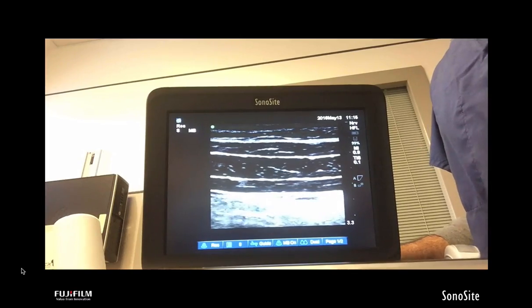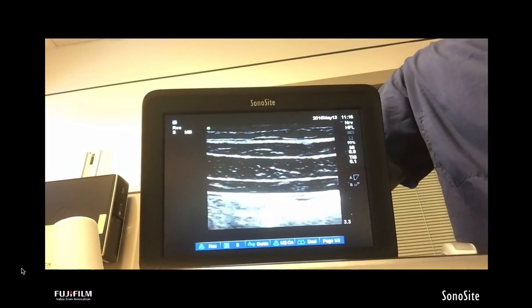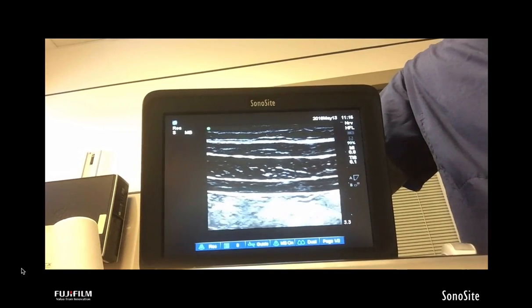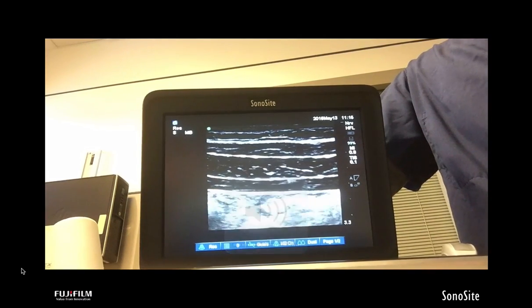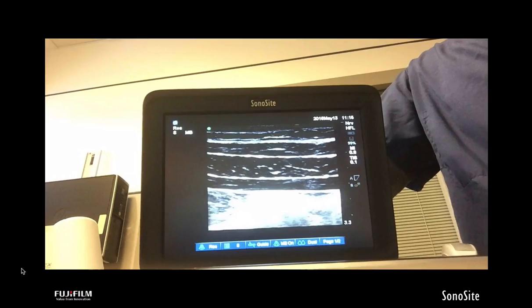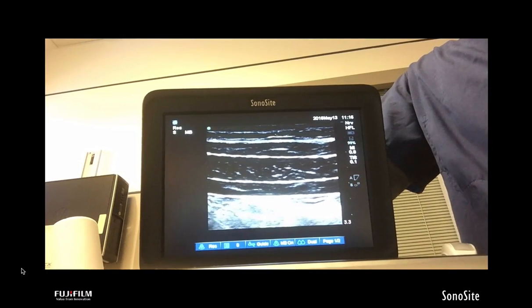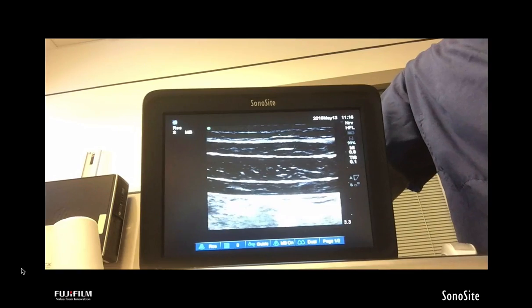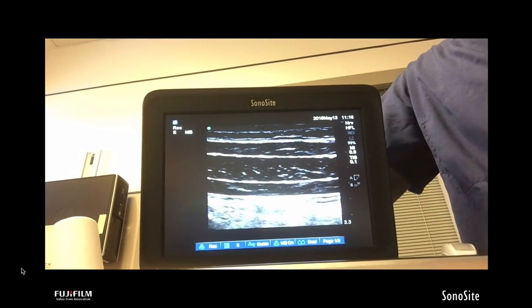What I want people to focus on here is the order in which I describe the muscle layers. I describe them from bottom up. The reason I do that is if we use the traditional approach of top down, in our society today we have many people that have extra layers of subcute tissue, of subcute fat, and as a result, some of the layers can be a little misrepresented when you're looking at the image, and they can appear as if they're muscle layers because of extra fascial layers or fat that actually looks like a muscle.